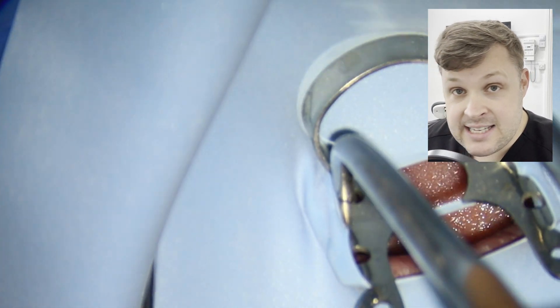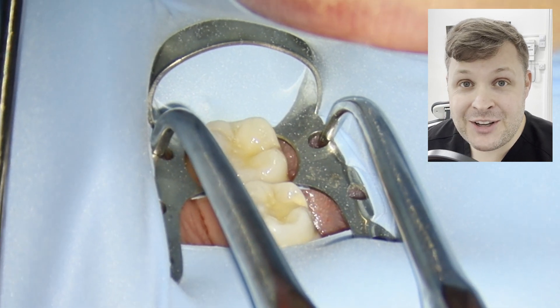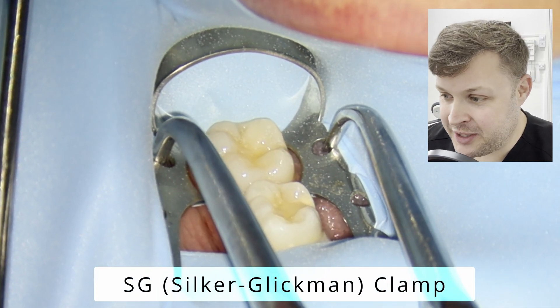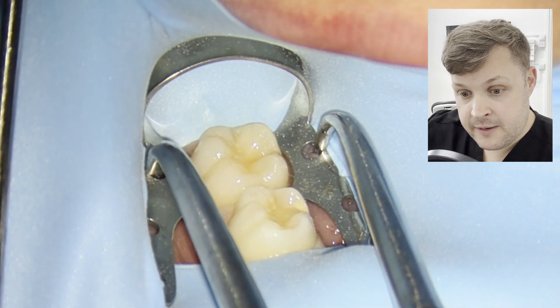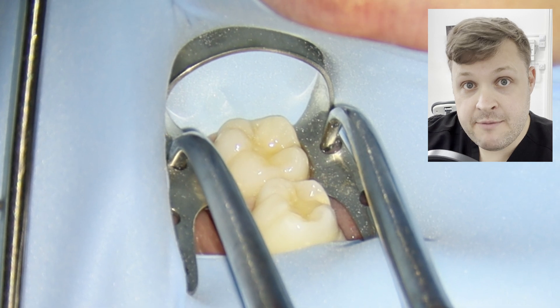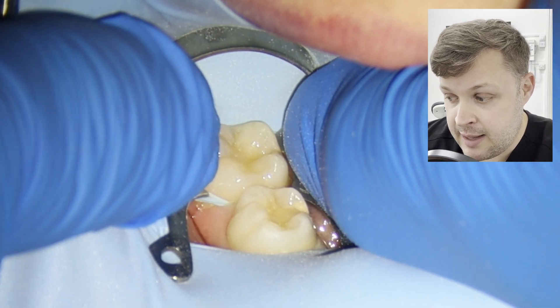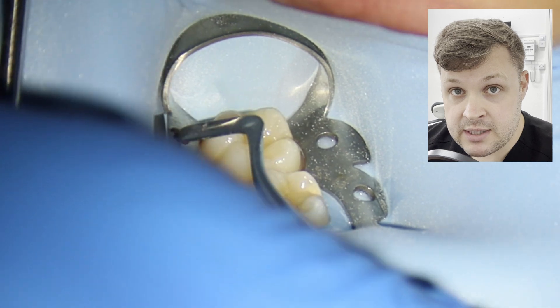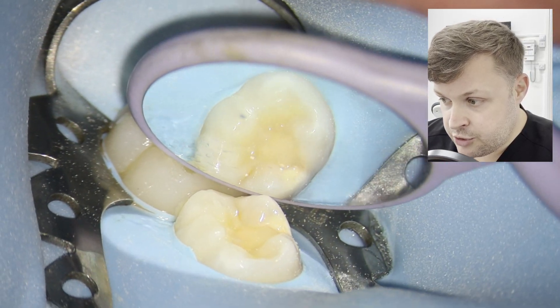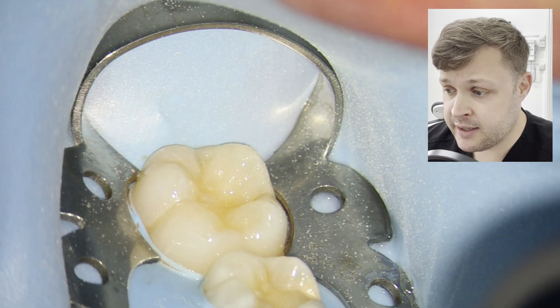To start the case, I'm isolating the tooth — that's really important. I've got one of these special clamps here; I'll put the name underneath in the video. It clamps the tooth behind but also extends anteriorly so you can isolate multiple teeth in front. This is really useful because the mouth is very small — if you just clamped one tooth there wouldn't be much space for suction and the drill to get in.